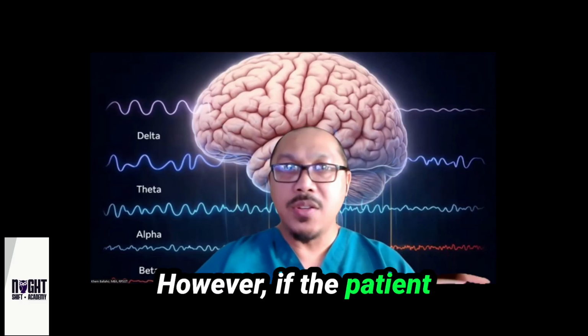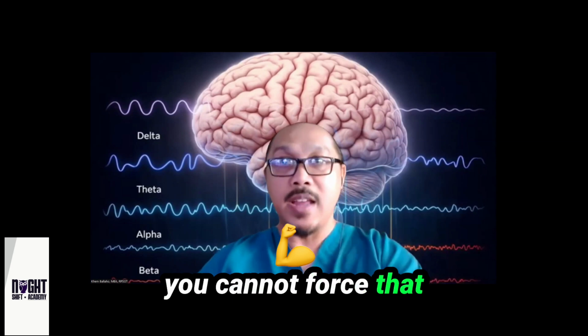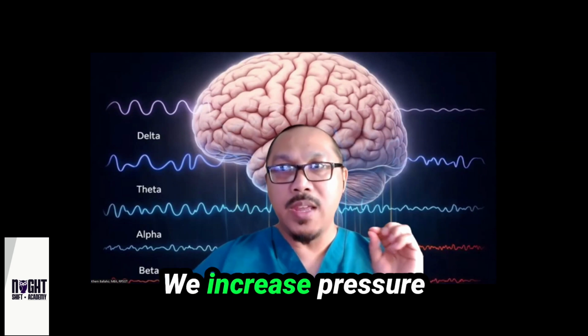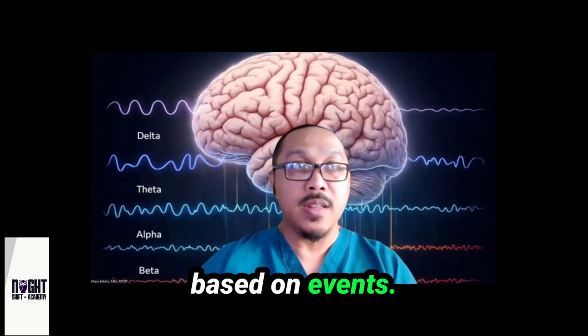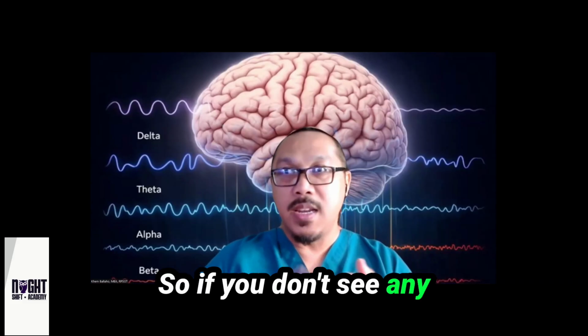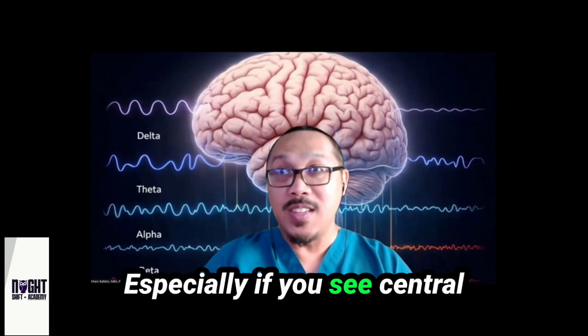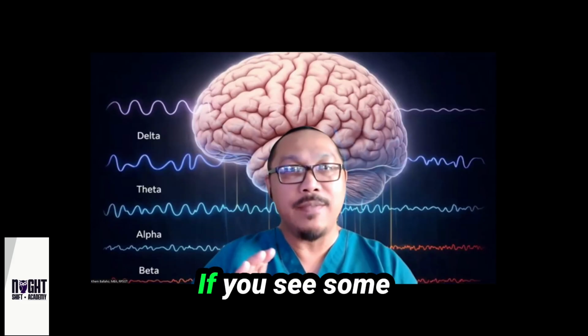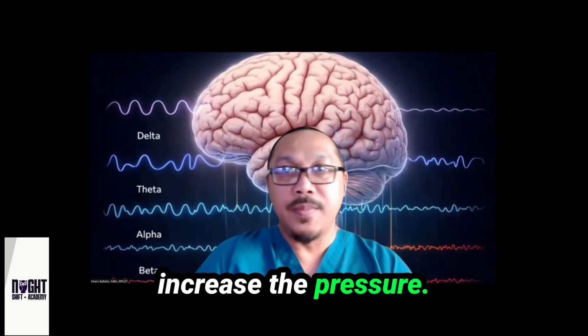However, if the patient does not reach REM, you cannot force that by increasing pressure. We increase pressure based on events. So if you don't see any hypopneas, you don't see any obstructive apneas, and especially if you see central apneas, you don't touch it. If you see some snores, then you can increase the pressure.